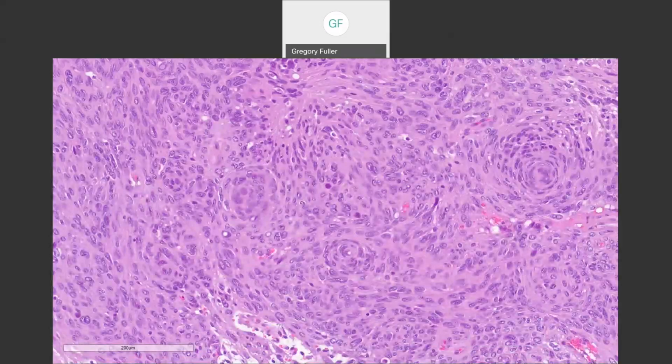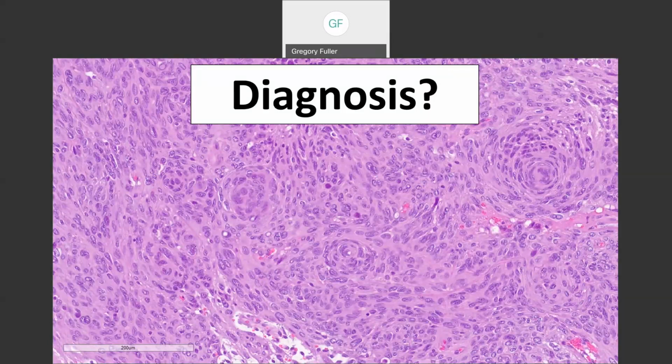Here we go. I'm sorry, this should have been an IPR diagnosis. Anybody got a diagnosis for this? We have to have something that everyone can get right. And Dr. Gilbert got it right. Good job. So did Dr. Alphatel. Meningioma. And Dr. Harb. Ashley Holloman, yes, welcome, Ashley. Meningioma. Great. Okay, guess what? You don't even get any credit for that. Hang on, because you guys are too advanced. I know you know that.